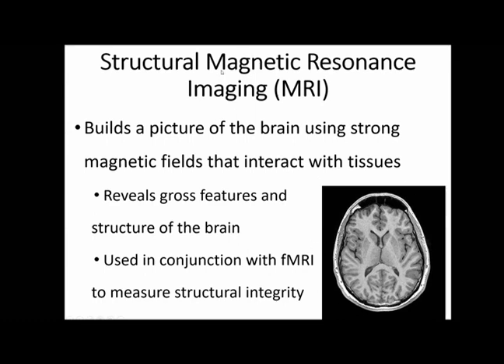And we use this structural MRI. I almost called it an SMRI, which I suppose would also be correct. But this MRI is used sometimes in conjunction with the functional MRI as sort of a roadmap that you can base an idea of function on top of, but an MRI on its own is also still really useful.